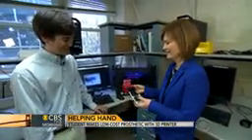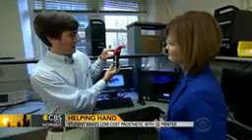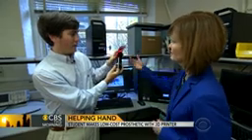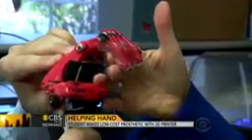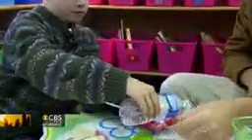So the way this works is it straps onto Holden's hand and onto the end of his forearm. When he moves his wrist in, the fingers close. When he moves his wrist out, the fingers open. And do that again. Do they have grip strength? So they actually do have grip strength.